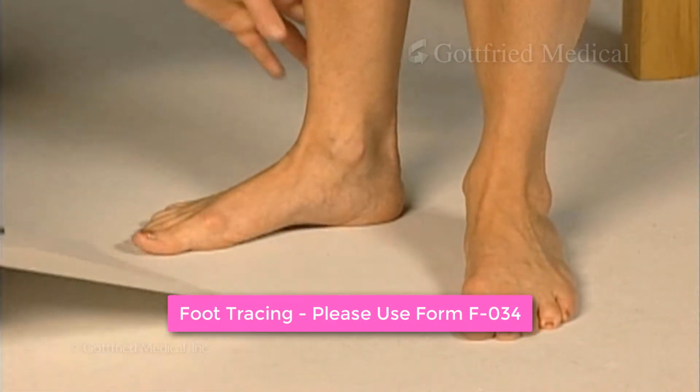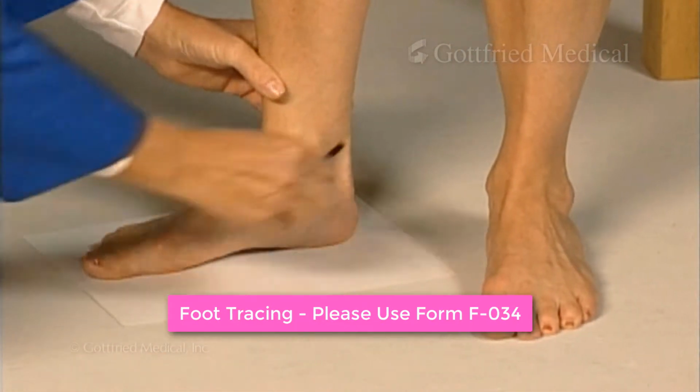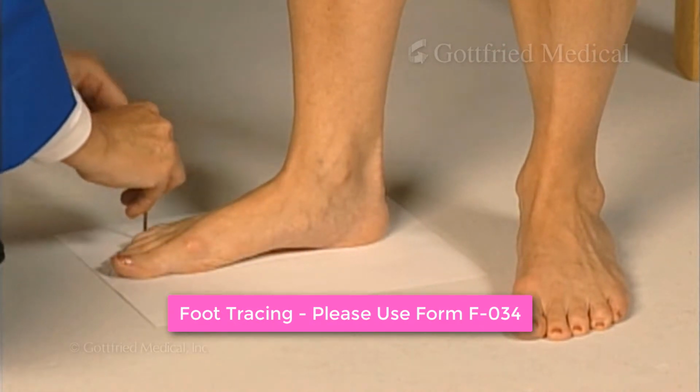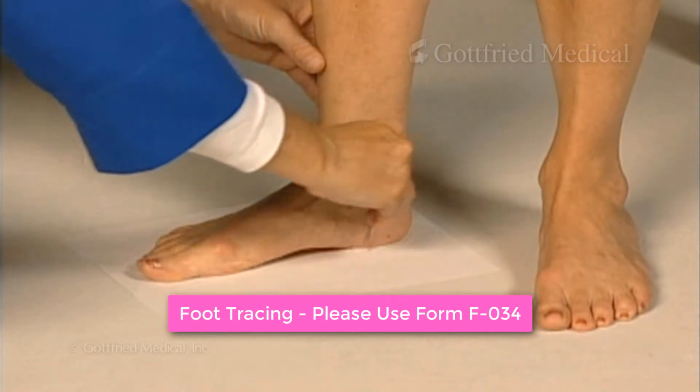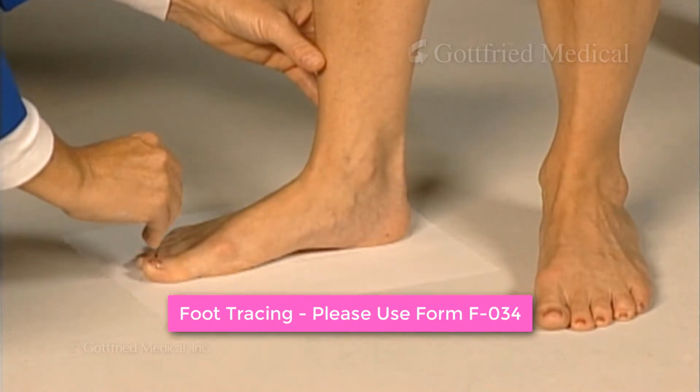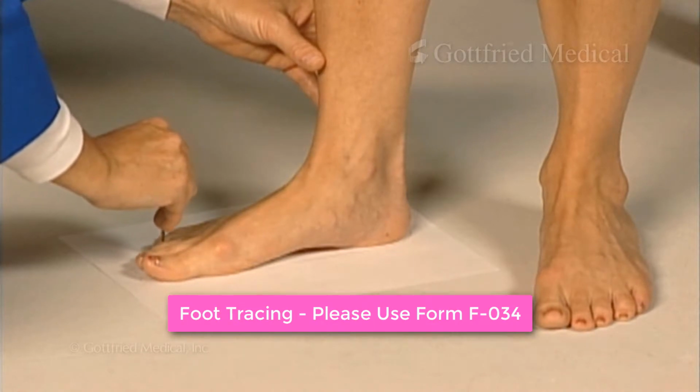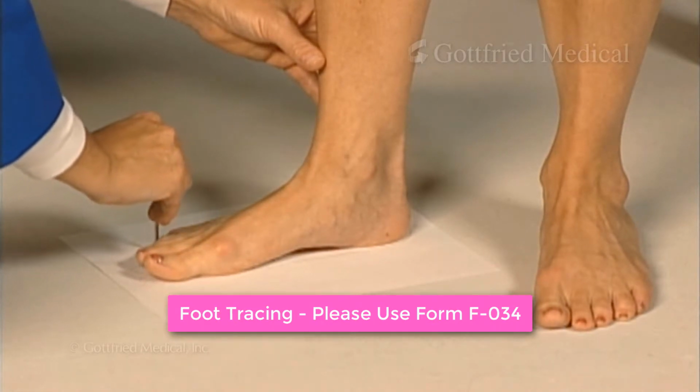The preferred method is to have them stand with the foot on a blank sheet of paper while you trace it. This allows for the possibility of a foot deformity. If a foot glove is required for control of edema or hypertrophic scarring, you will need to trace the entire foot, outlining each toe to the web.